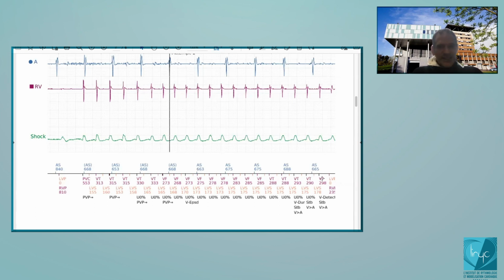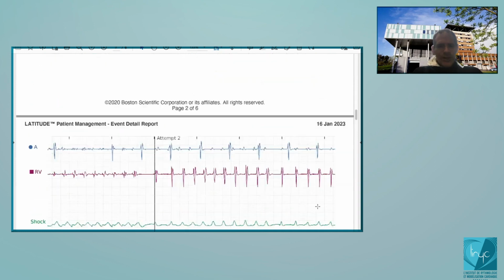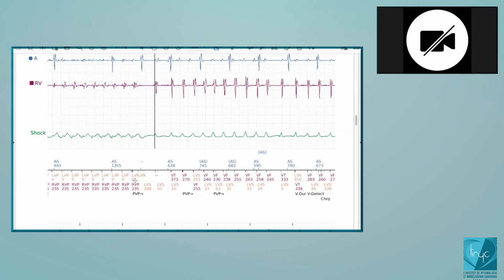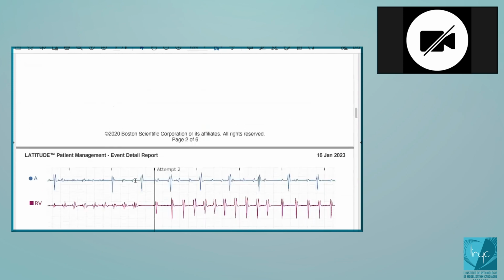At this time the duration for the VT zone was finished, but you could not deliver. You cannot deliver here. But at this time, you can deliver, and that's what will happen: you will deliver the ATP for the VT zone. You understand? Is this clear? Yes, it's clear.